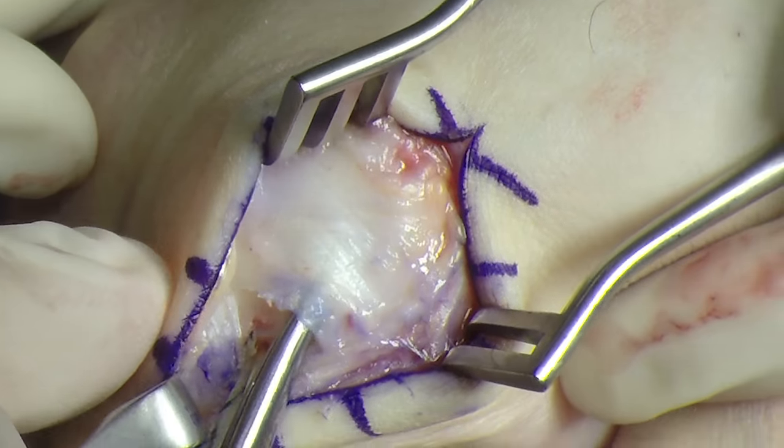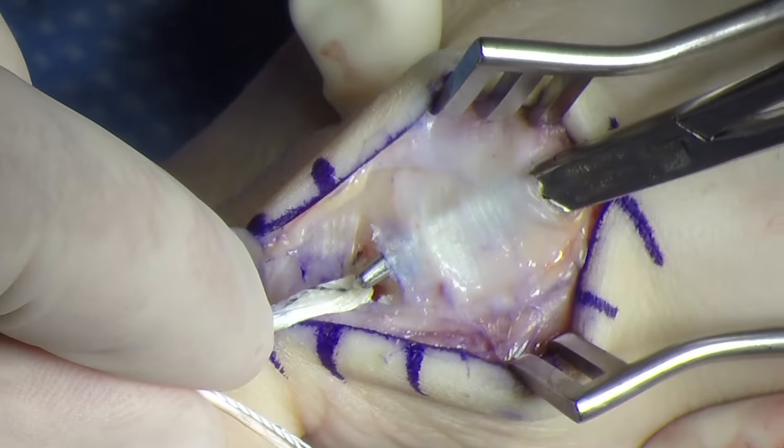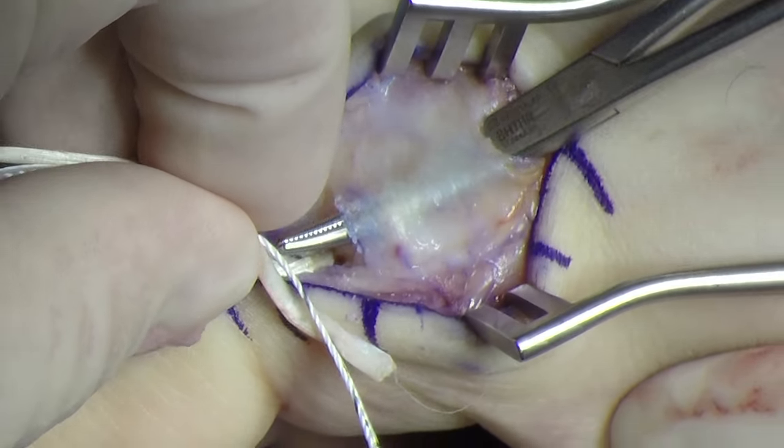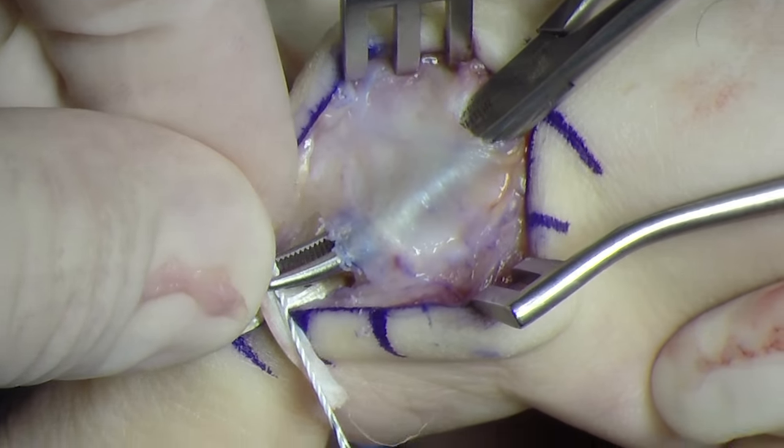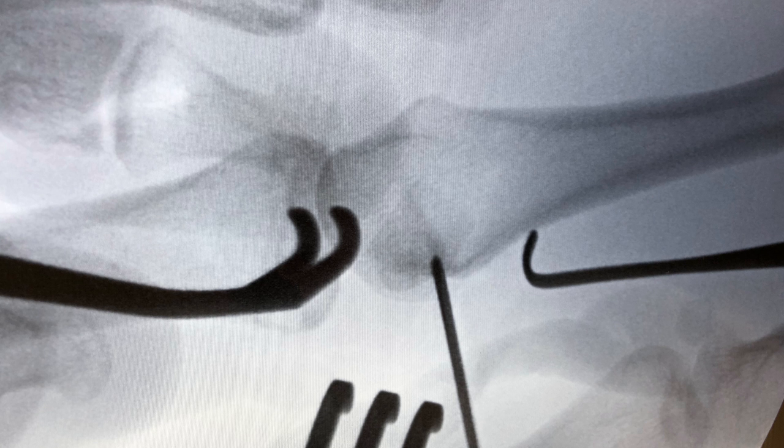The interval between the collateral ligament and the sagittal bands is developed. The suture tape and graft are passed between the interval. The insertion of the collateral ligament on the dorsal aspect of the metacarpal head is confirmed with intraoperative fluoroscopy.